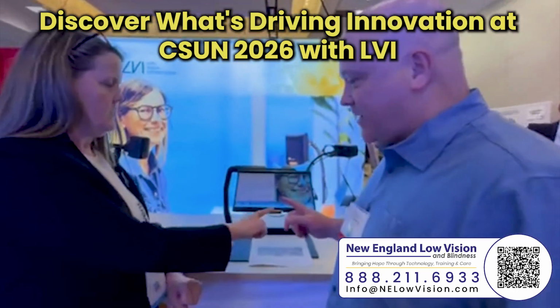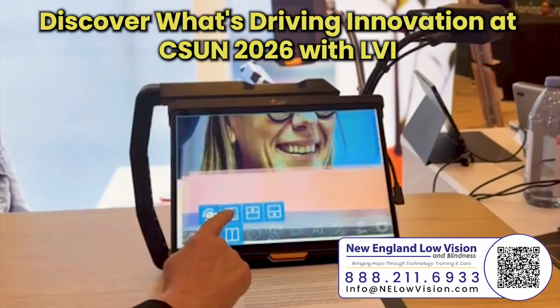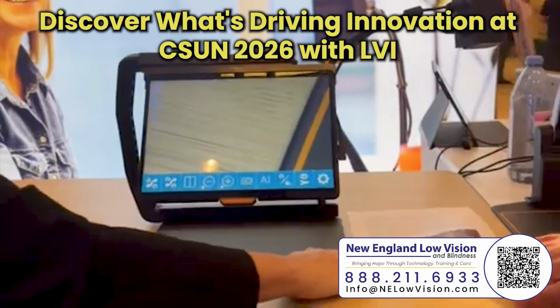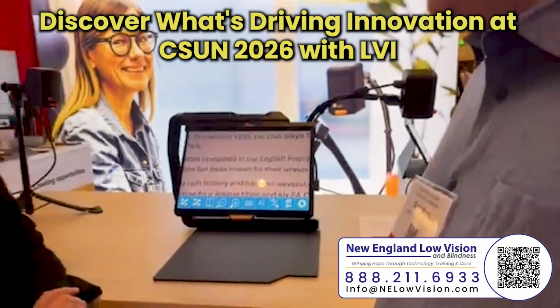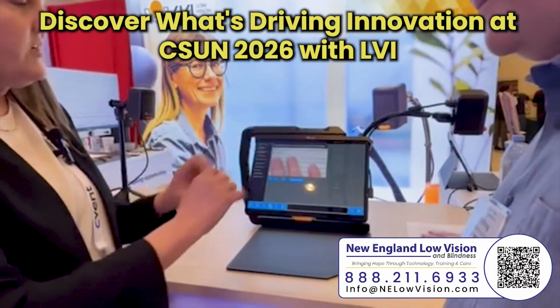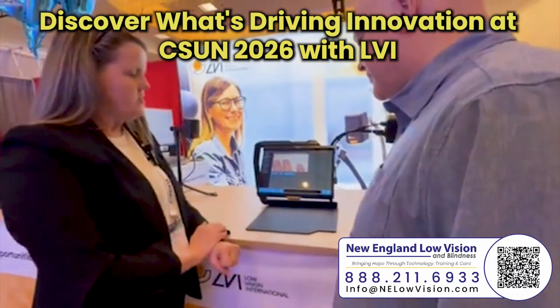Because I see a word there, two initials. It looks like something like AI. What is AI? Let's switch this around a little bit. There we go. I'm going to bring this down. So AI is integrated into this tab viewer software. The cool thing about it is we've got something under the camera. Put your hand back under there and let's see what it says. If I hit AI, the magic is it's an interface that is easy for people with vision loss to use. You can adjust the interface so it's easier to see.